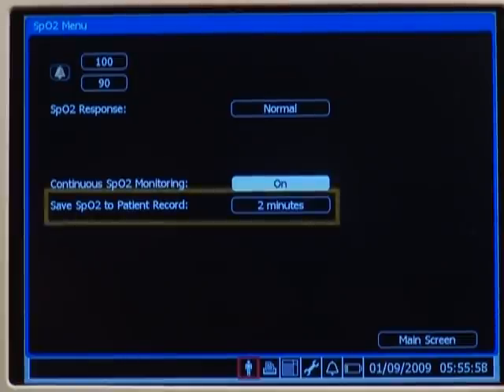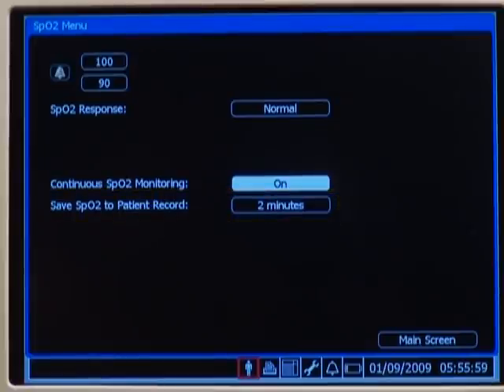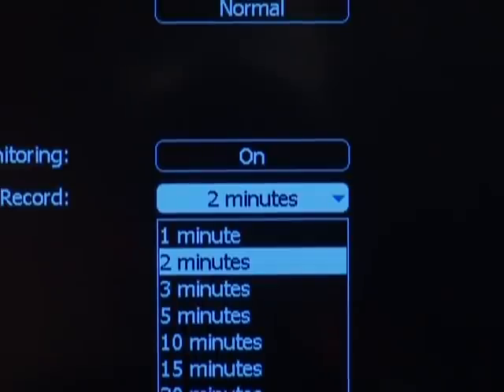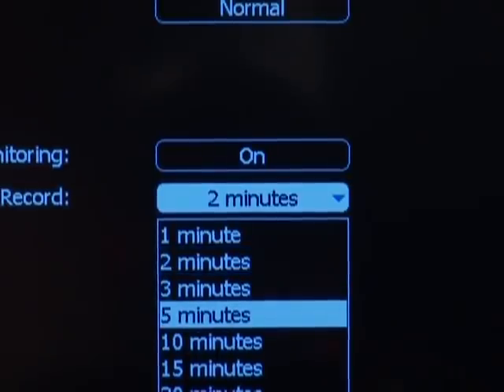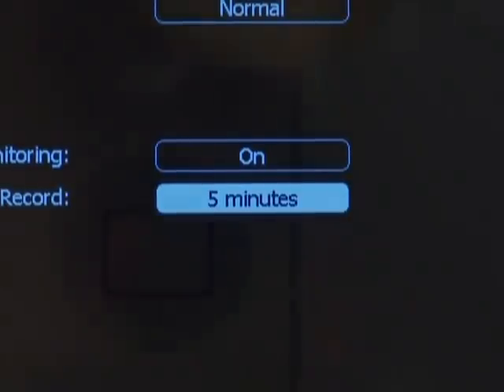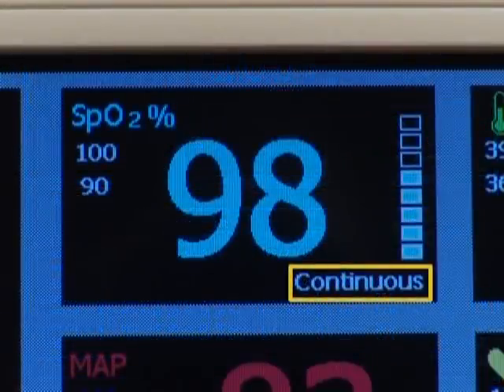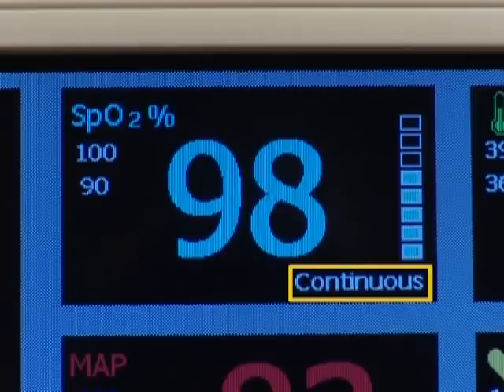When you select on, the save SpO2 to patient record option appears. This option allows you to specify how often the monitor will save an SpO2 measurement to the patient's record. Select the save SpO2 to patient record option and choose one of the interval options. Press the main screen button on the front panel to close the menu. The word "continuous" appears in the lower right corner of the SpO2 numeric pane.